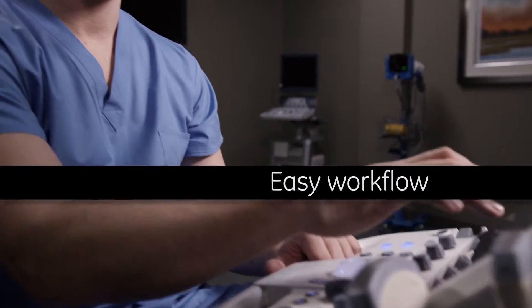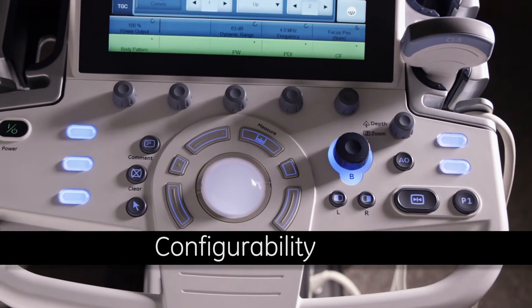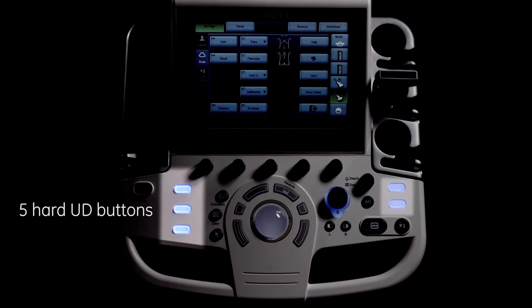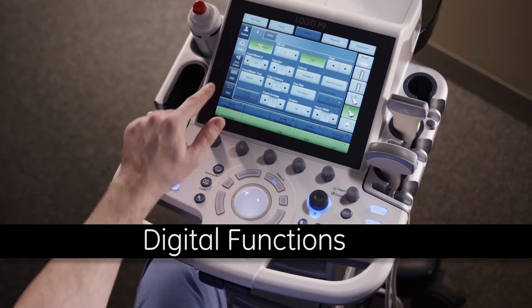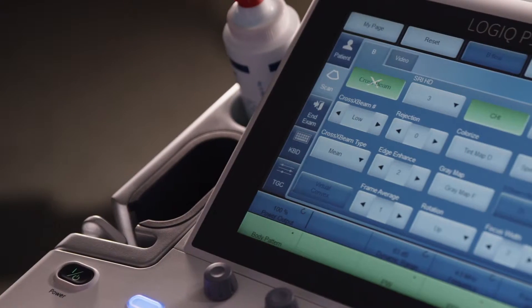The system offers you a new way to work. User-defined keys help users quickly access the most often used features: five hard UD buttons, five soft UD buttons, and five soft mode buttons. Digital functions offer streamlined workflow, including digital TGC and digital keyboard.